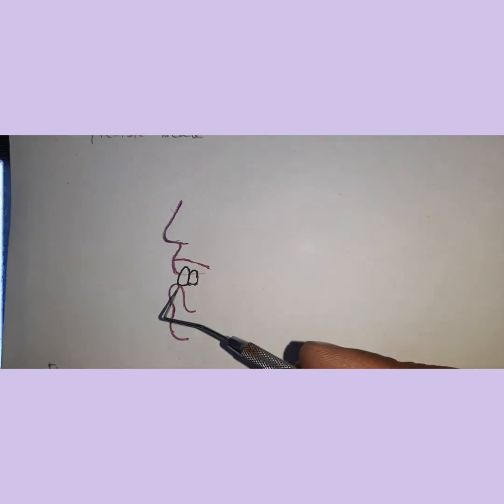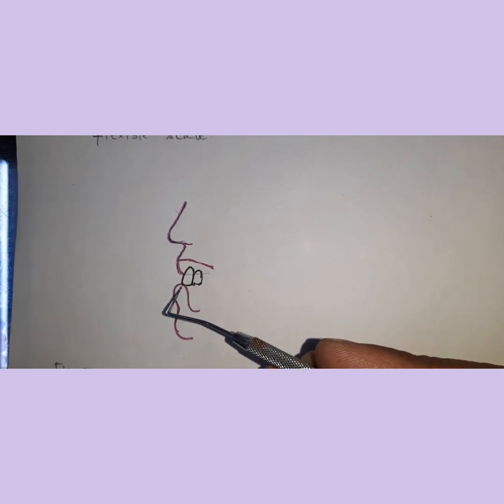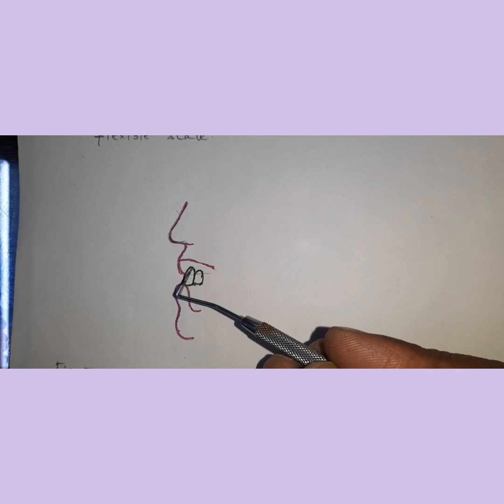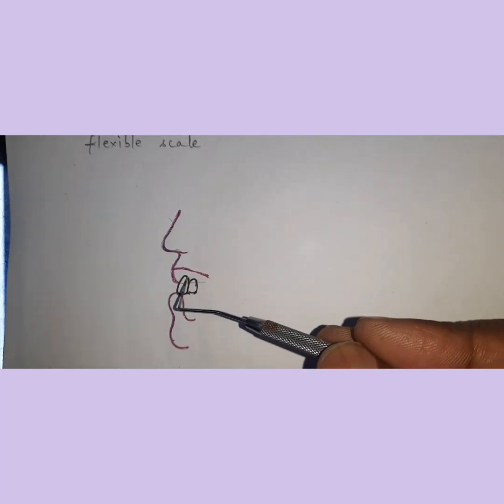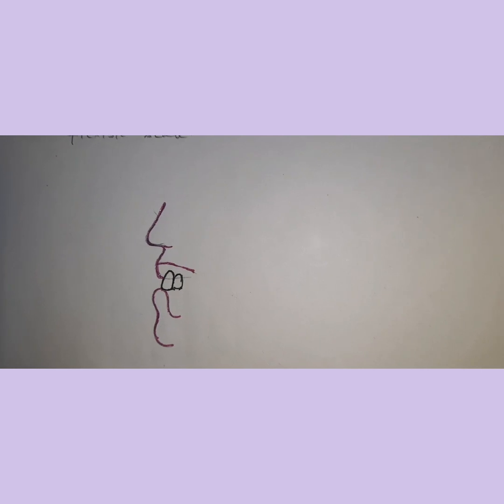So that is how it should be. Your arrangement should be such that you select the size of the teeth so that you can fulfill this criteria. Accordingly, you have to determine where the lip support is and where the contour of your teeth would be. That will be helpful in determining the size of the anterior teeth.